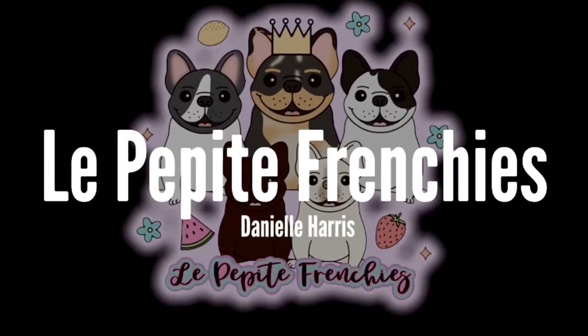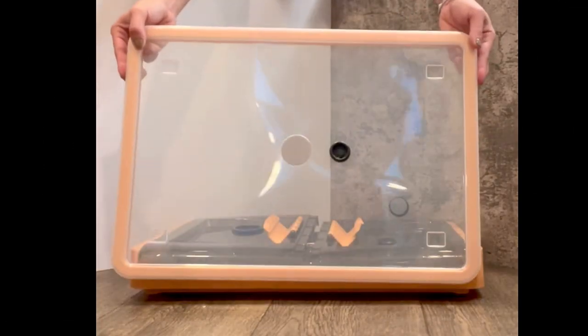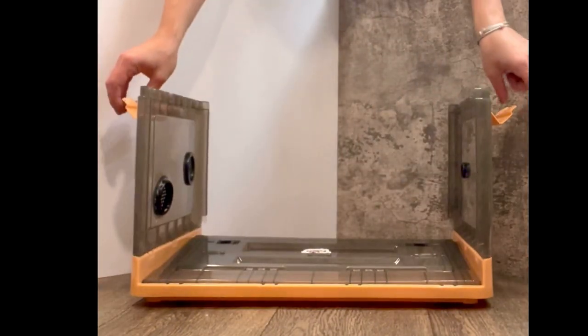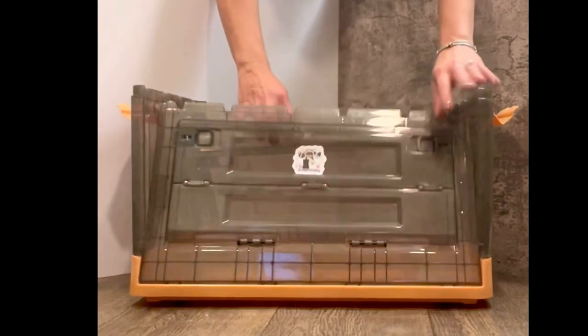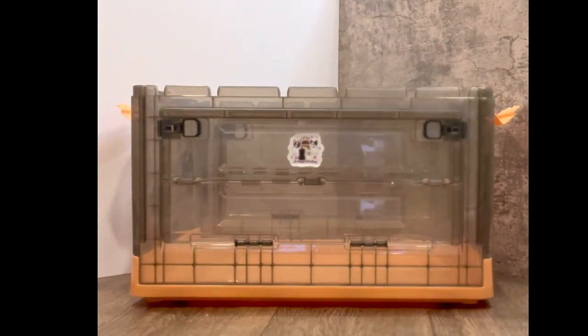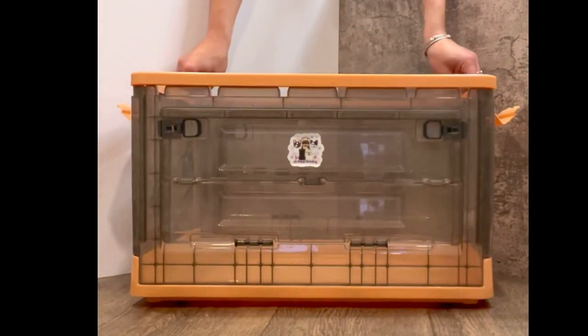Setting up your LPF Incubator. First, remove the lid from the box and set aside. Unfold all sides. Once the sides are standing up, add the collar to stabilize the box to finish setup.